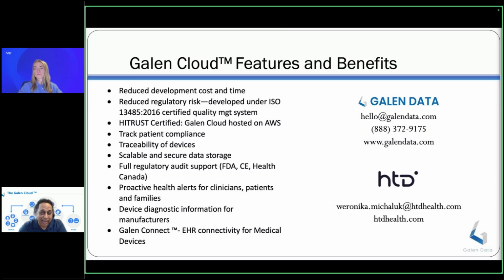For the FDA, there is specific language that says the clinician has to be able to independently verify whatever support you're giving. It becomes harder with LLMs to do that. So there's a very gray area again. Both of us are not regulatory experts, so you do need to get regulatory advice on this one.